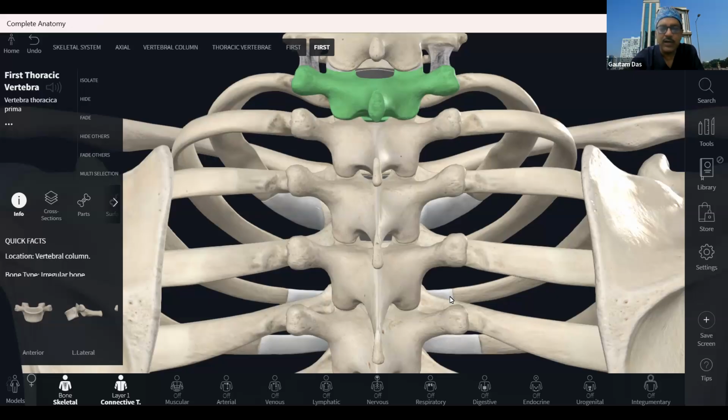If we go a little more lateral, then the transverse process slope will be starting on either side. Again, in this area the transverse processes are very elevated, closer to the skin. When we get the gap between the two bones, that means you are at the lateral edge. This is your superior articular process, and this is the inferior articular process. As soon as soft tissue comes between these two, slide a little bit more medially, and you'll be able to see the facet joint area.